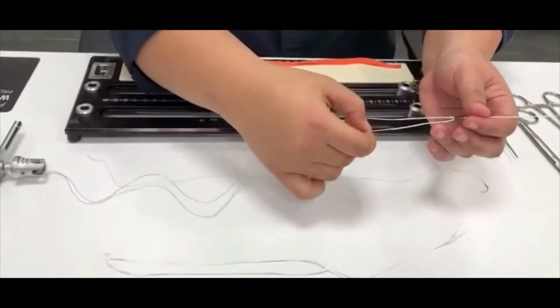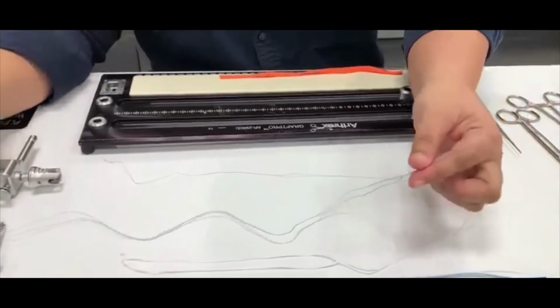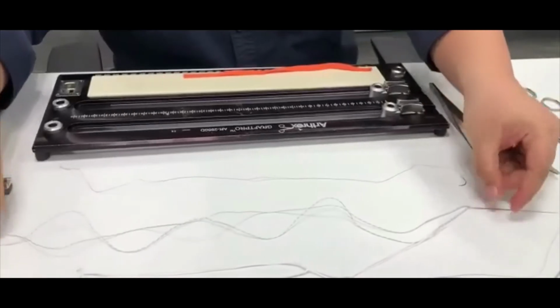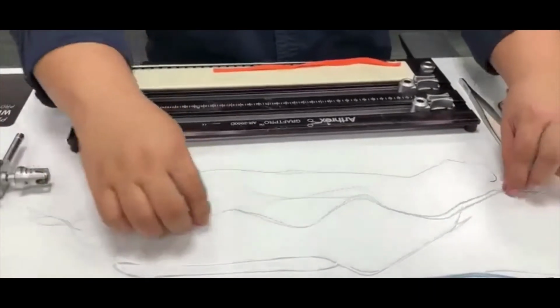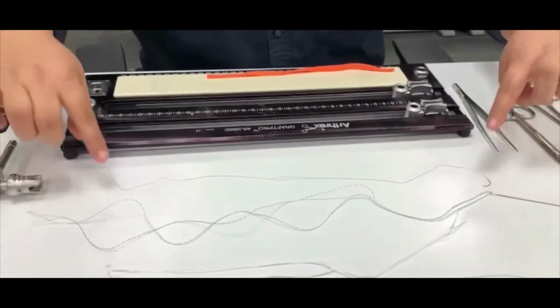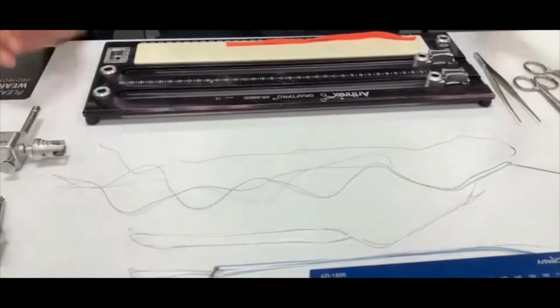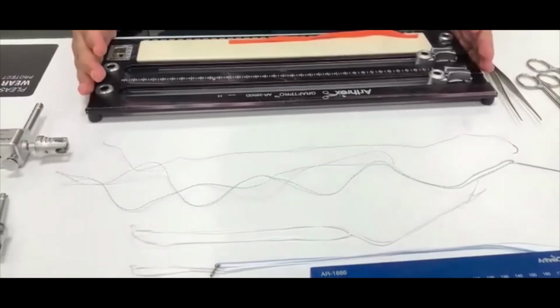FiberLoop is just another FiberWire which is already looped naturally and connected to a straight needle. The FiberLoop is to whip stitch the graft, and Prof will always use number 0 FiberWire to tubularize. Okay, this is the graft board.